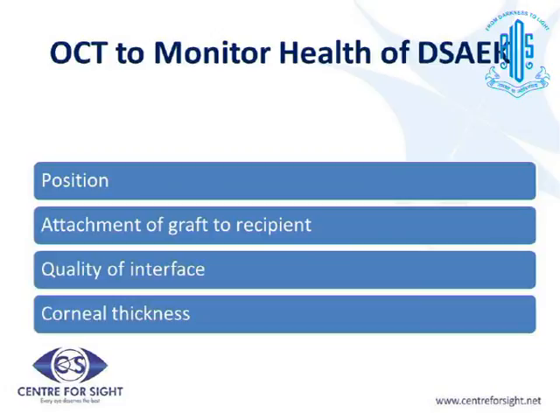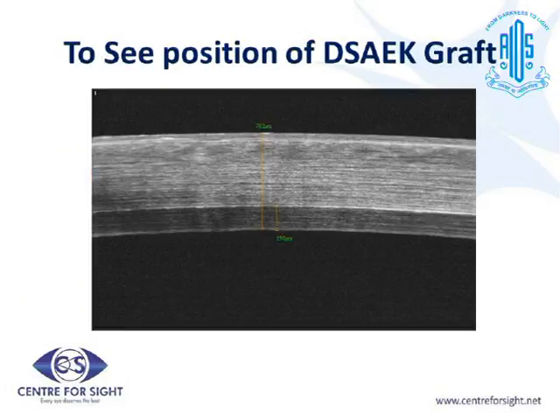Now, for the corneal surgeon, it is also becoming an important tool to monitor the health of the DSEK graft, to know the position, attachment, quality of the interface, and corneal thickness. So this is a scan showing very nice attachment of the DSEK graft on day 1, along with a little bit of corneal edema.